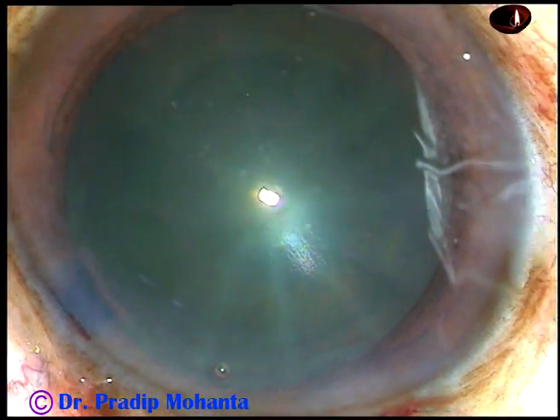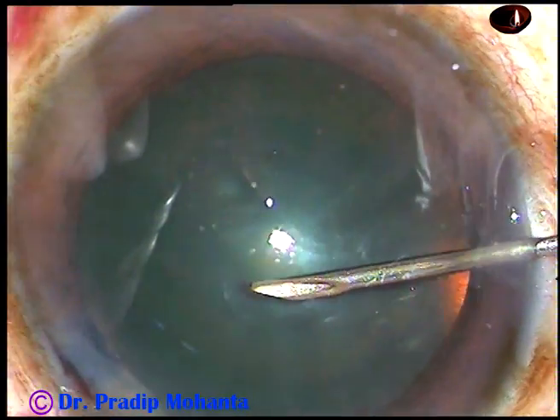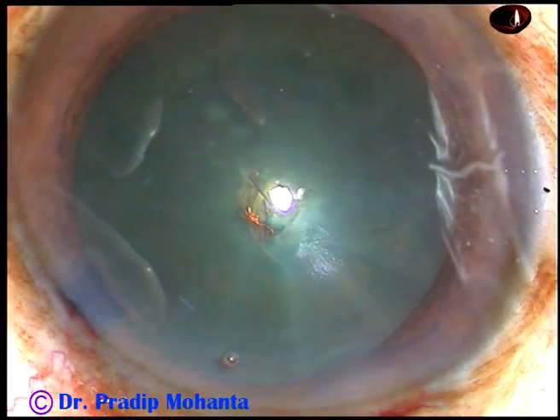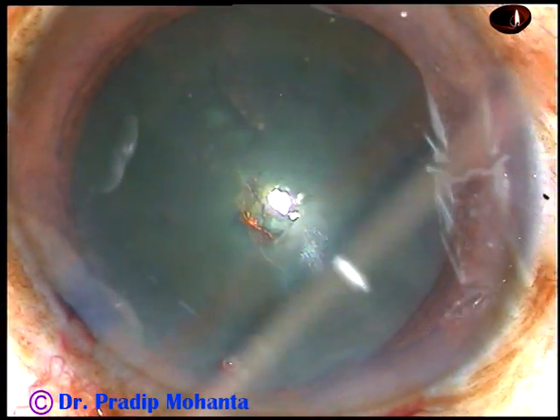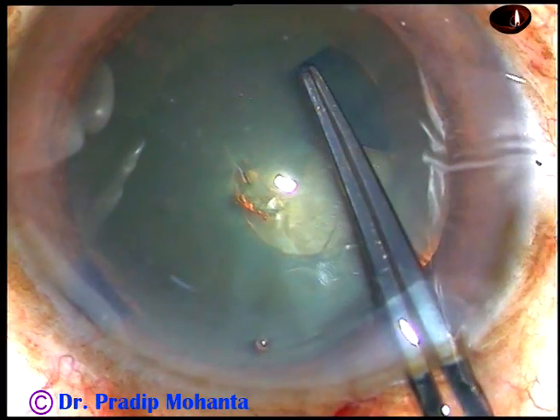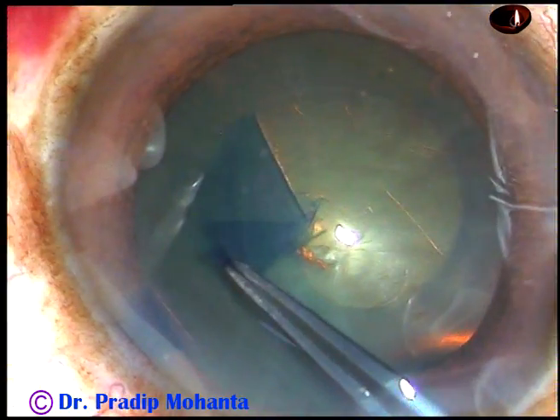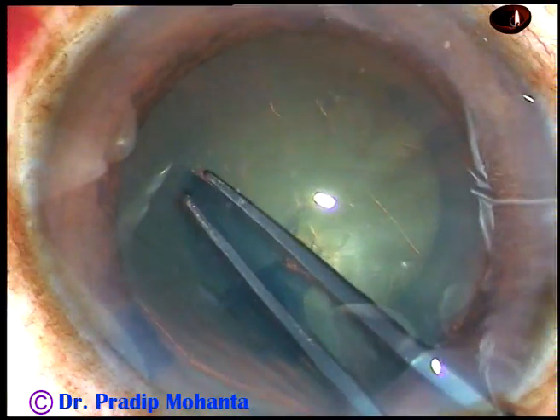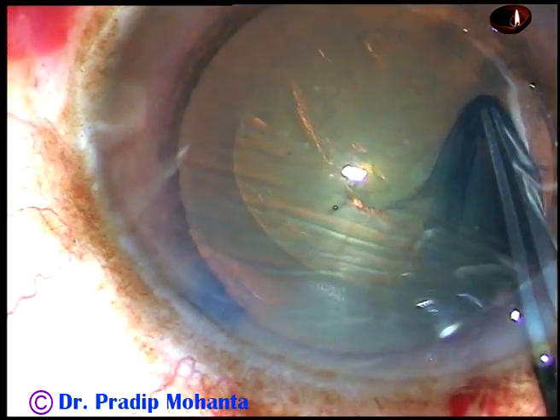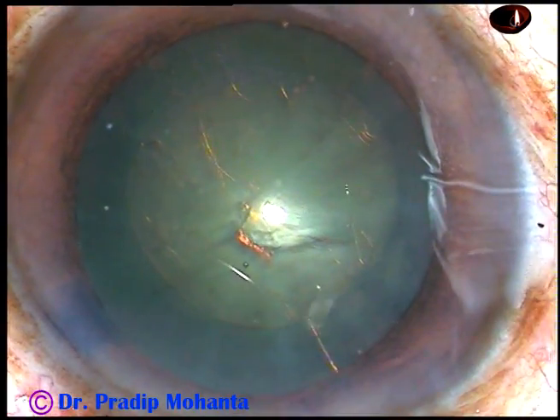And now capsulorhexis is to be done. What I do is I incise the anterior capsule with a bent needle cystitome, then use a Utrata forceps to hold this capsular tag and go anti-clockwise all around. In this case, as you can see, the rhexis is becoming quite small, but it is adequate for phacoemulsification.